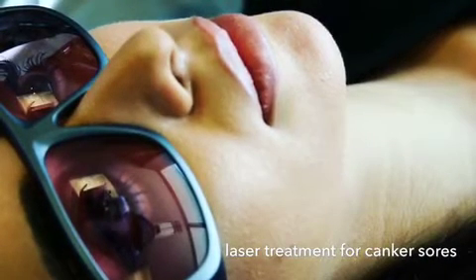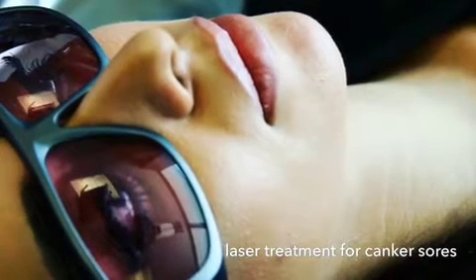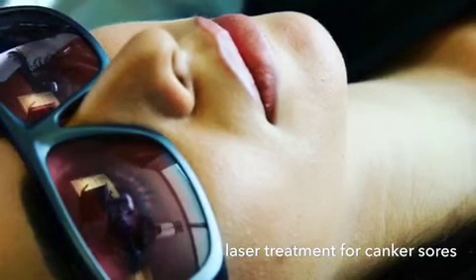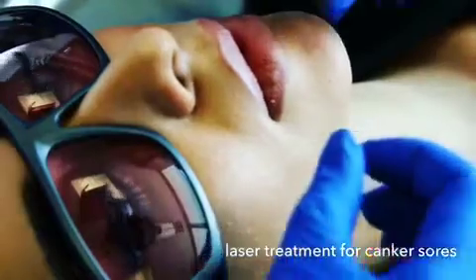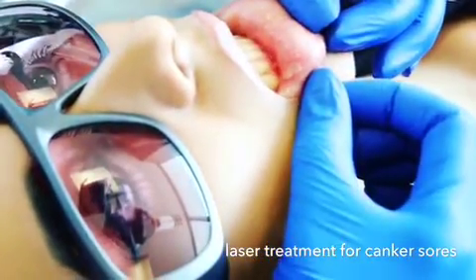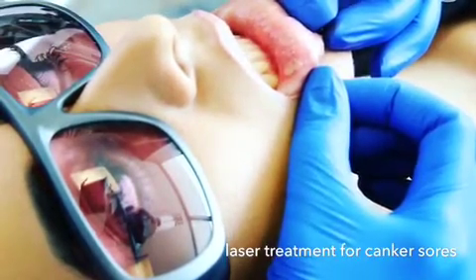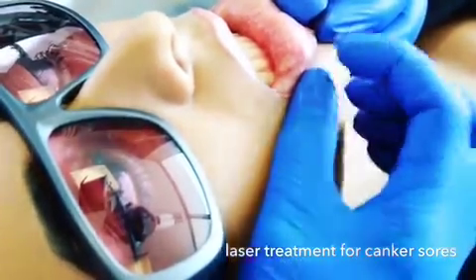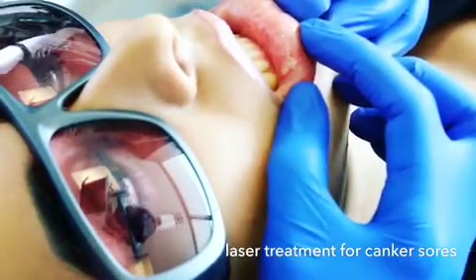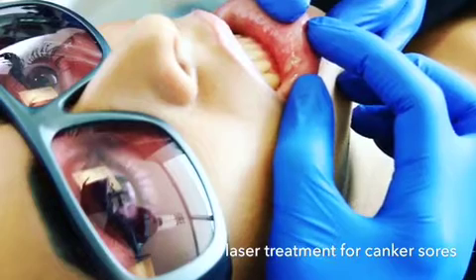Today we have lovely Tiffany with us. Tiffany came to work with a large aphthous ulcer on her lower lip, which is very common for women around her age in early 20s. As you can see, it's a large white area surrounded by red — that's a typical aphthous ulcer, visible in the area of non-keratinized tissue.